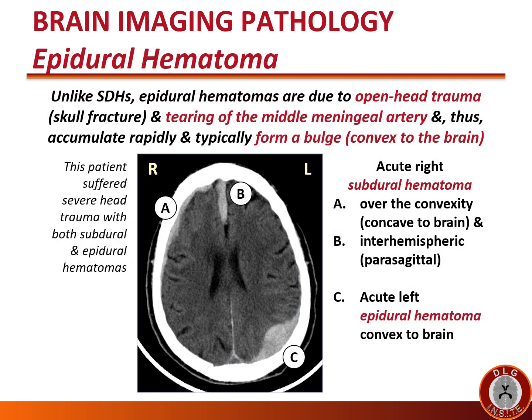Unlike subdural hematomas, epidural hematomas are due to open head trauma with skull fracture and tearing of the middle meningeal artery, and thus accumulate rapidly and typically form a bulge convex to the brain. In this patient who suffered severe head trauma with both subdural and epidural hematomas: label A marks the acute right subdural hematoma over the convexity, concave to the brain; label B marks the acute interhemispheric or parasagittal subdural hematoma; and label C marks the acute left epidural hematoma, convex to the brain.